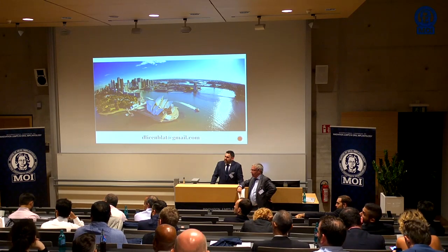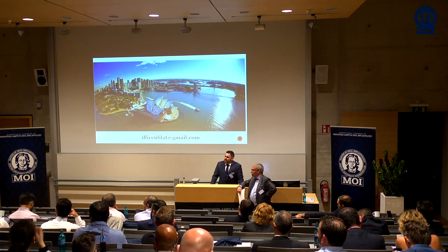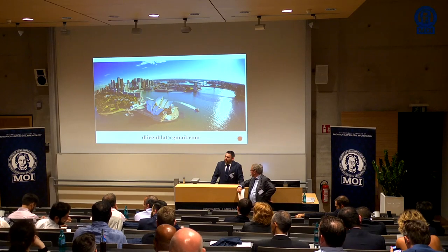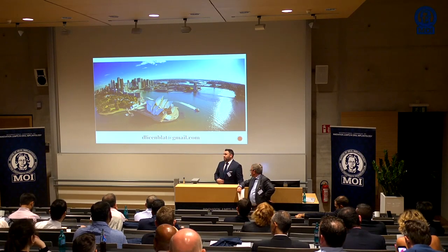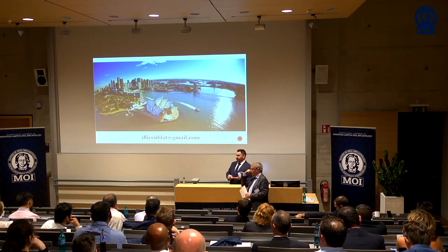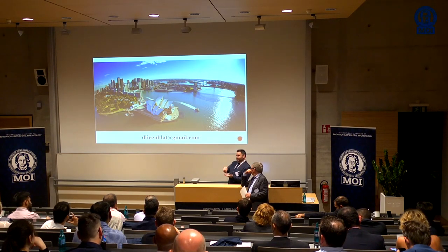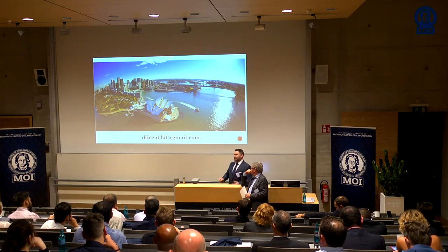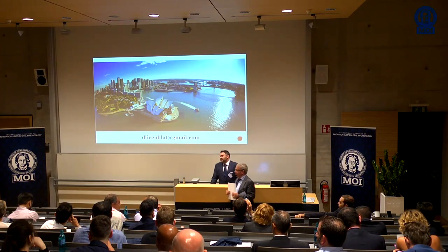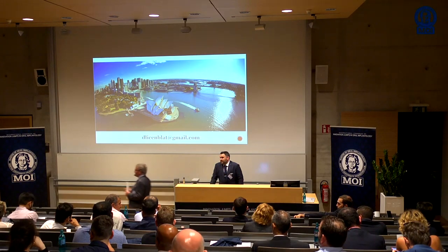So your study, did you have any sort of exposure to the histological part of things? No. The second question will be, did you measure the secondary stability before you restore, with an Osstell? I wanted to do that, and that was part of our original design, but there is no RFA unit that will allow you to test zirconia. Yeah, there's no adapter. We looked at Periotest. Even if you use the thing that clicks on, it has some movement in it, so it gives you a false reading. I think it's just going to break the bone contact, even with secondary stability. If it's stable and you use resonance, it's probably going to fail too.